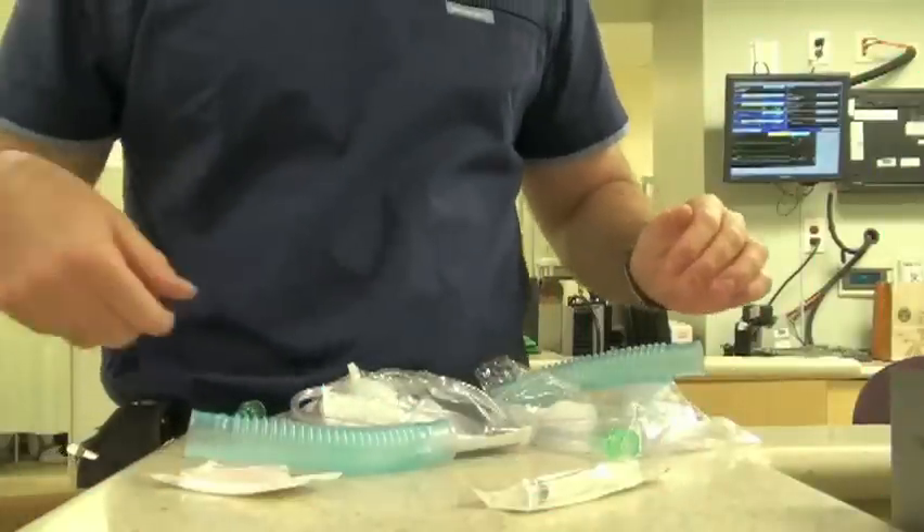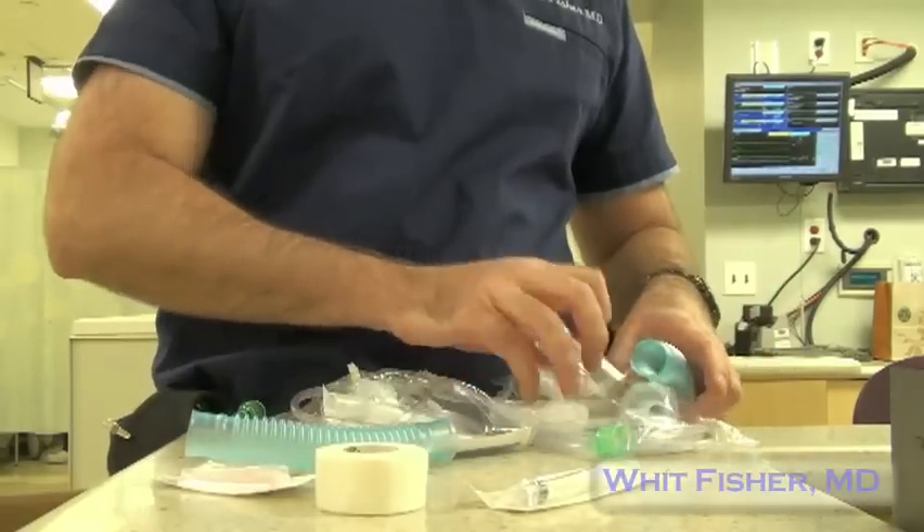Albuterol spacers can be pretty expensive, up to $60 at some pharmacies. You can make a spacer using two nebulizer kits.